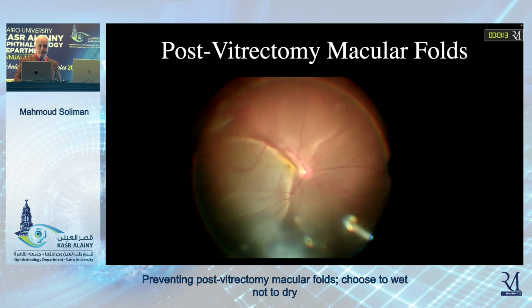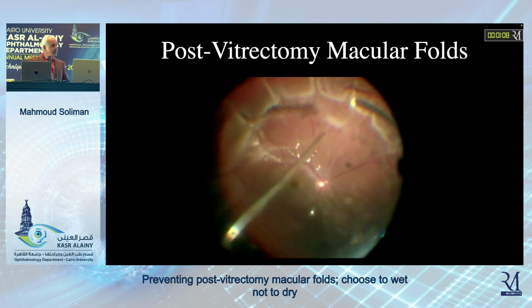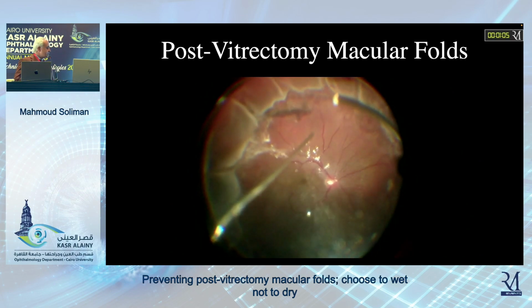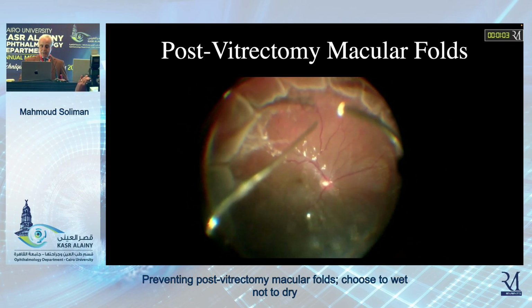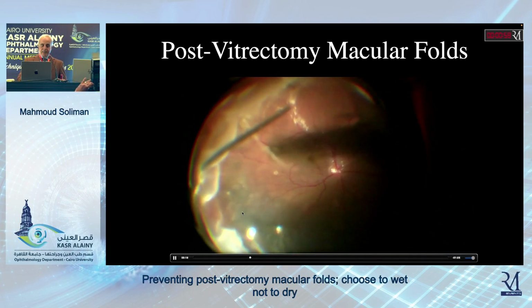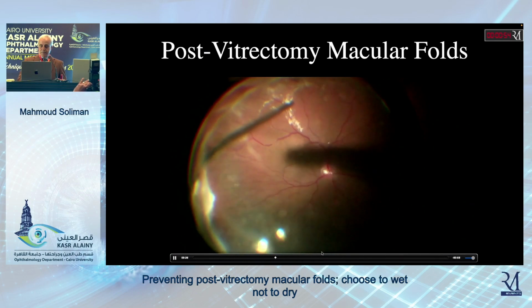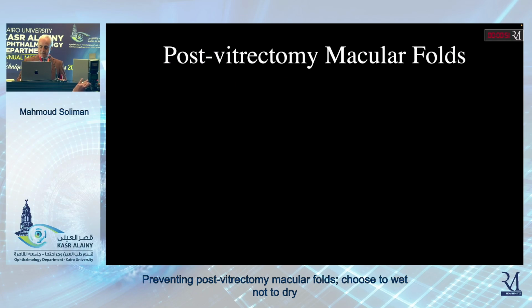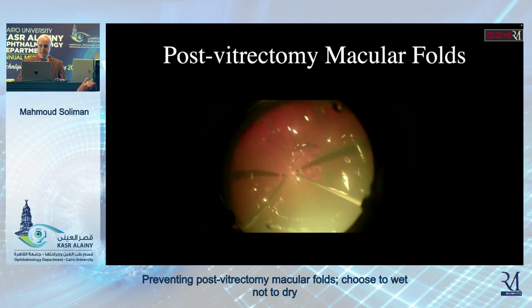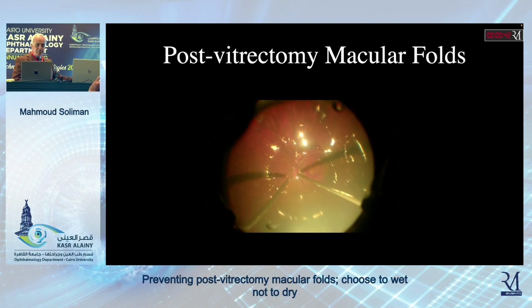Another patient. Again, the upper bullous retinal detachment. This patient has a buckle, as you can see here. I flattened the retina and removed all the PFCL. Sorry, excuse me, the next patient. Again, another patient here. Flatten the retina with the PFCL. Remove the PFCL completely. This is for people who use PFCL.